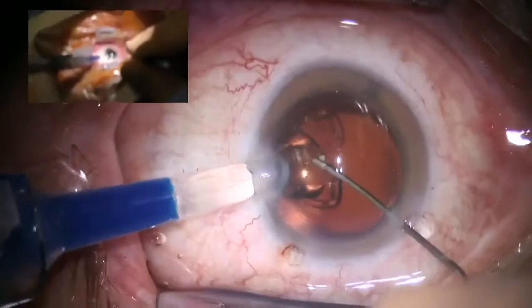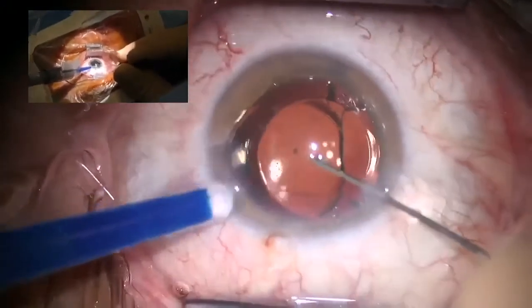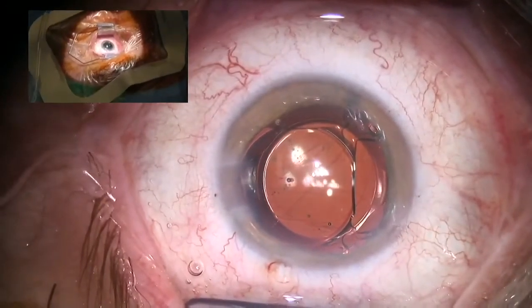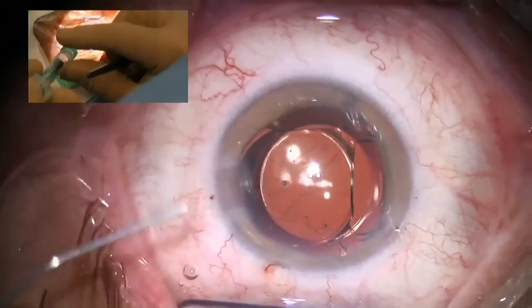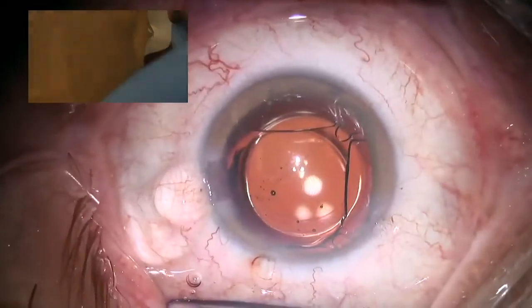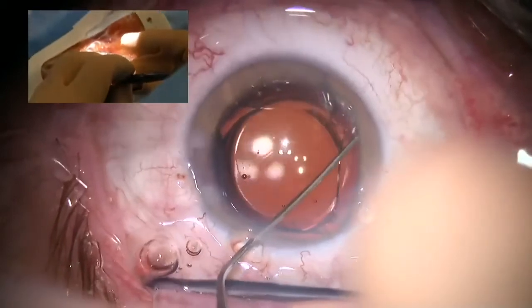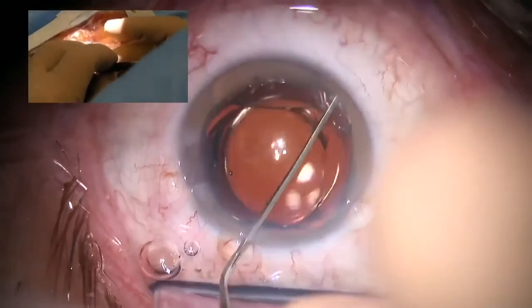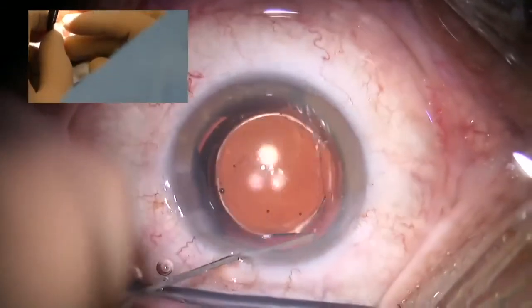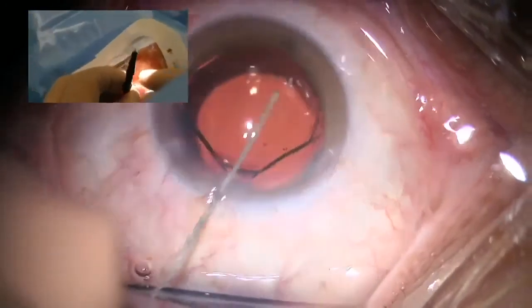Stabilize your eye, help the lens to unfold. It doesn't matter where the haptics are at this moment. The only thing you have to be crucial about is the fact that the haptics must not be underneath the rhexis.